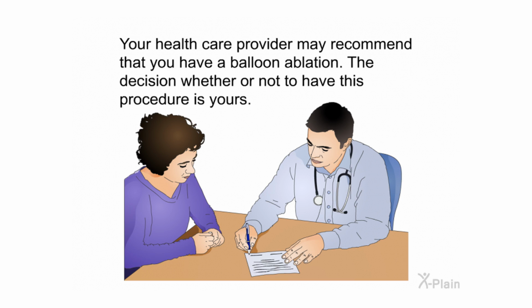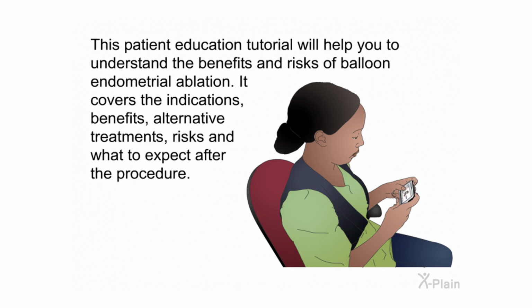Your healthcare provider may recommend that you have a balloon ablation. The decision whether or not to have this procedure is yours. This patient education tutorial will help you to understand the benefits and risks of balloon endometrial ablation. It covers the indications, benefits, alternative treatments, risks, and what to expect after the procedure.